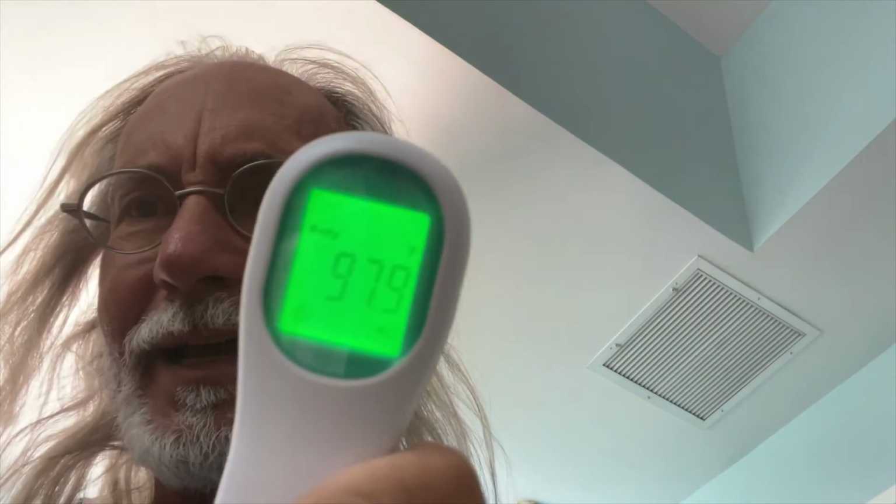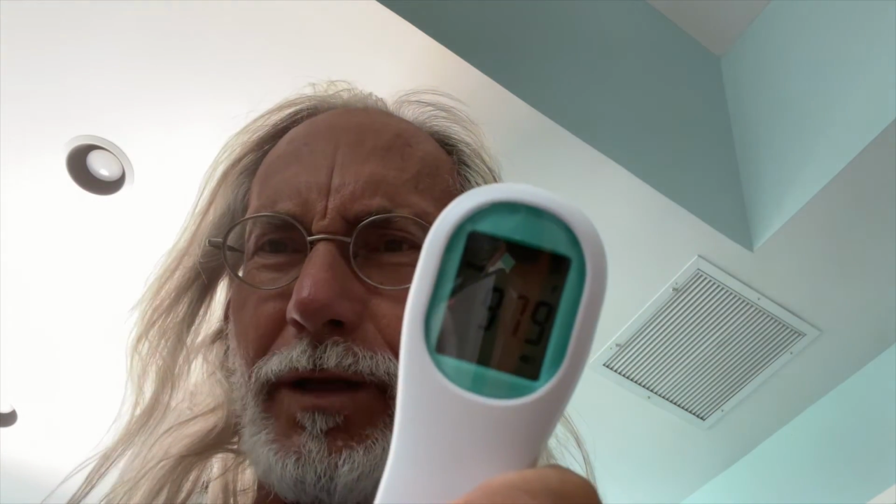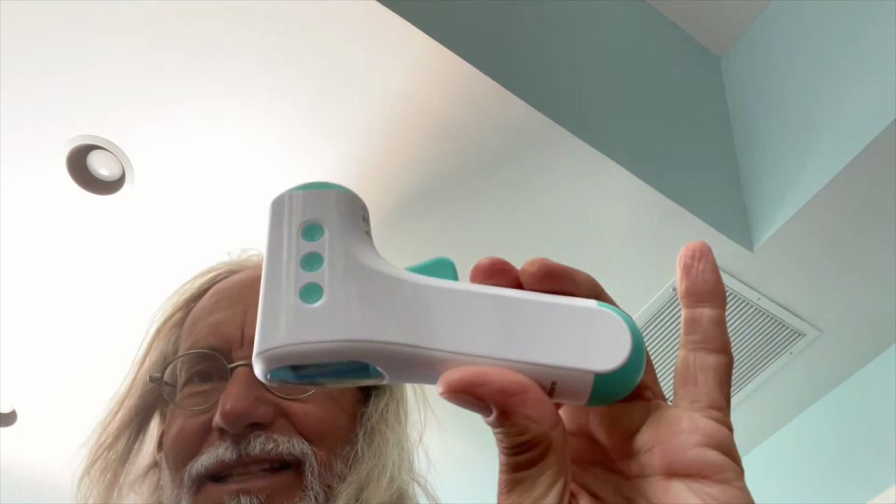Okay, here she is. I'm going to get her right up here. You ready? I guess I could even touch my head, but it's supposed to be non-contact. There we are. Now I'm at 97.9. I must be cold. All right, that's it. There she is. That's how you use it.